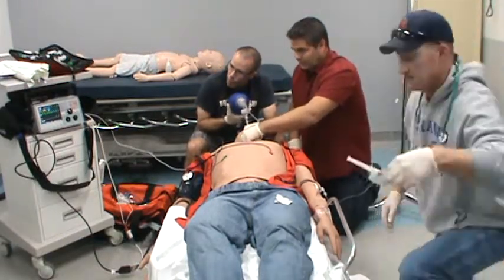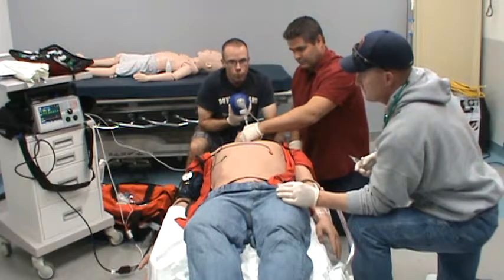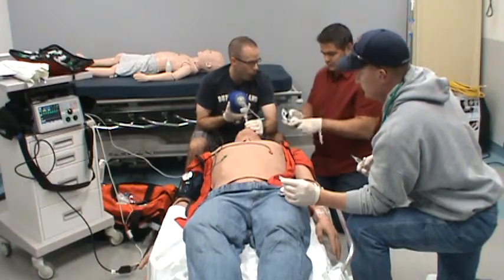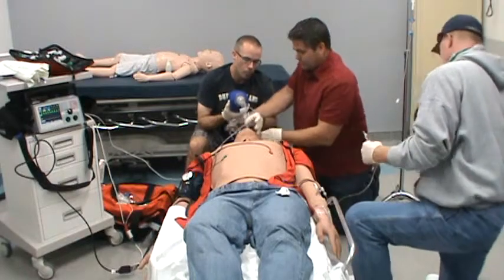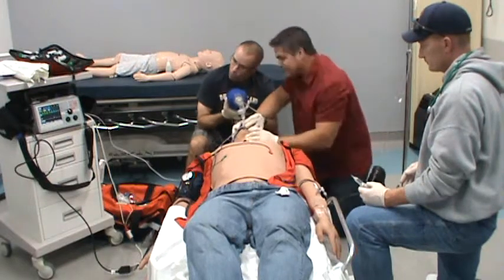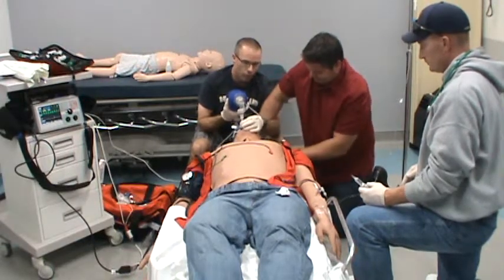Looks like we're at about 48. So I'm going to pick up the ventilations just a little bit to bring that CO2 down. We're going to try to maintain it around 40. Let's go ahead and secure our tube before we give that vec. I'm just going to maintain my ventilations until I get our CO2 down to around 40.